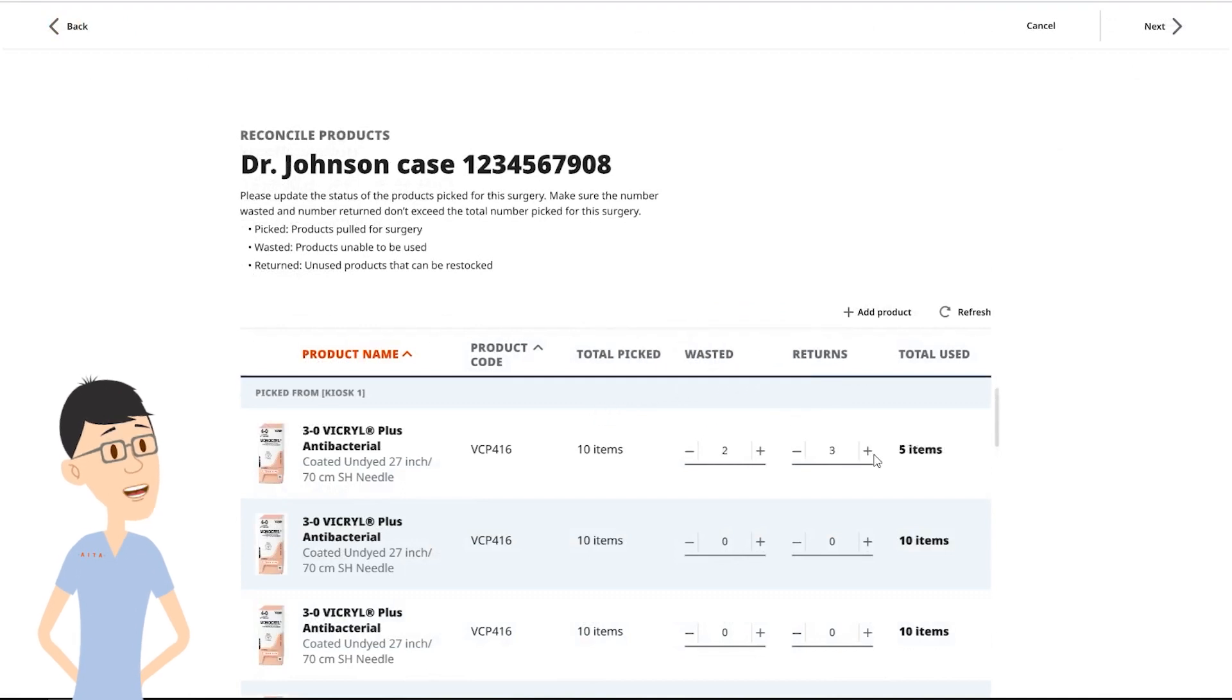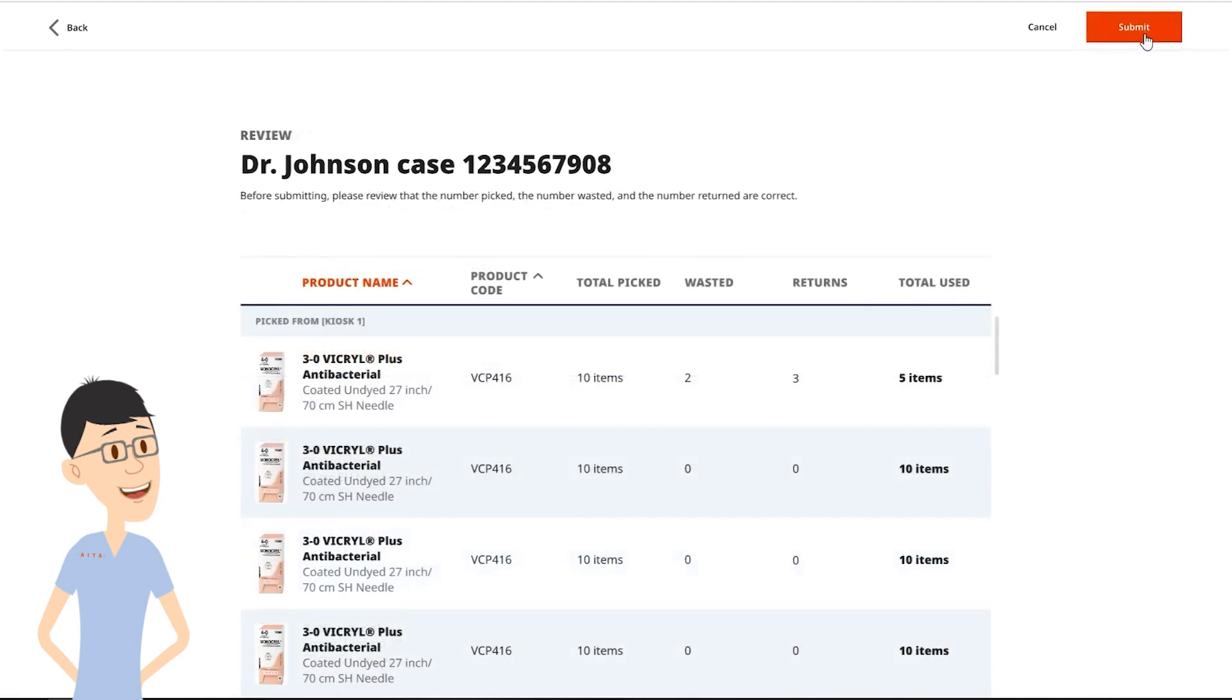Repeat for each product as necessary. The system will calculate the total number of sutures used during a procedure.